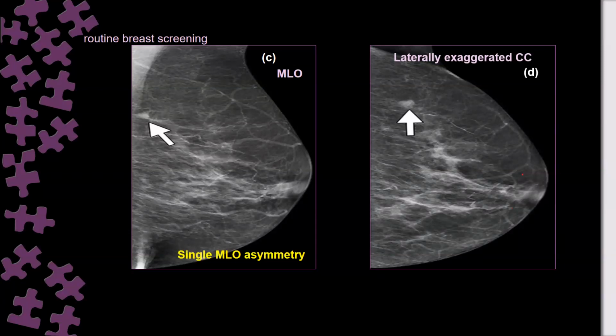But this one is mostly a real lesion from its shape, appearance, effect and associated features. When it gives the impression that this is a real lesion, I'm not doing the spot just to make sure whether it is a true lesion or a pseudo lesion.